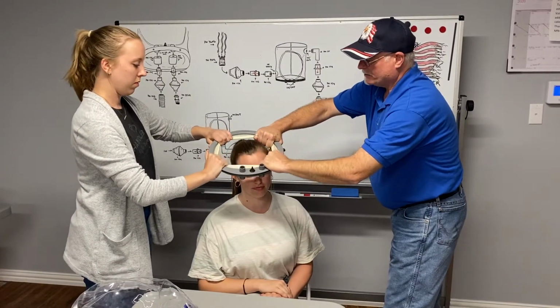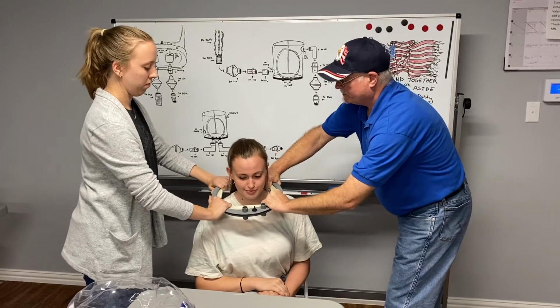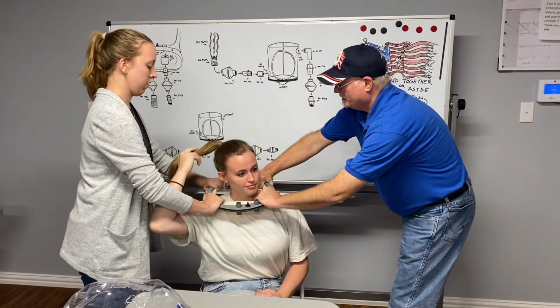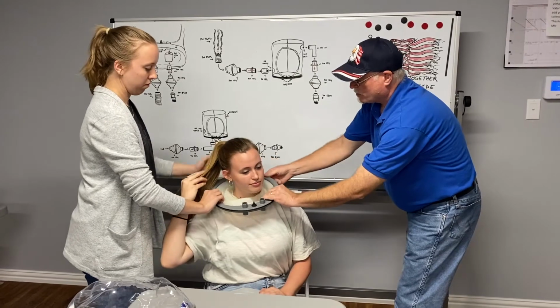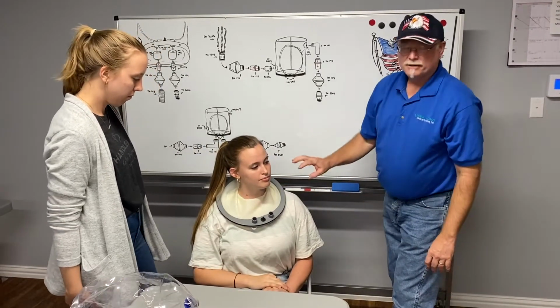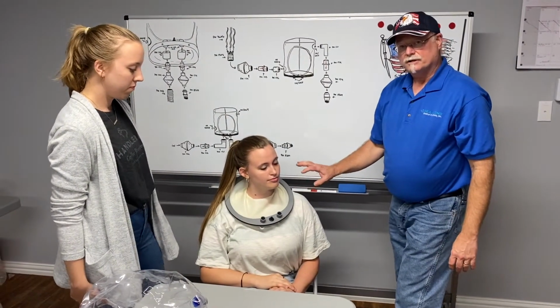You want to lean it a little more over the front part of the head first, and give room for the chin and the mouth. Now, if you will please bring your hair up. Now we'll slowly let this loose, maintaining the roll, because you want the roll to sit on the patient's neck. You can see how this is actually rolled. It's much more comfortable for the patient, and it also ensures a better seal.